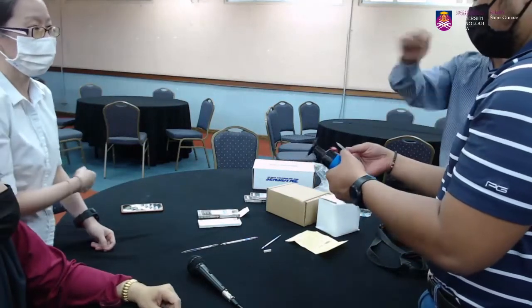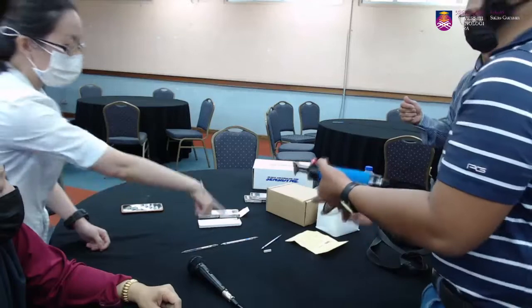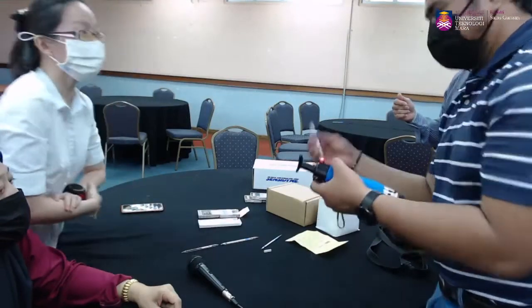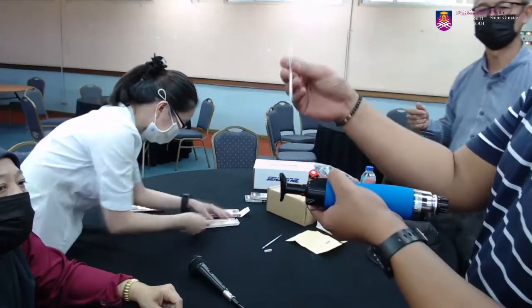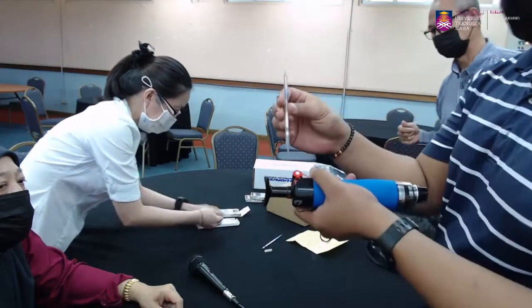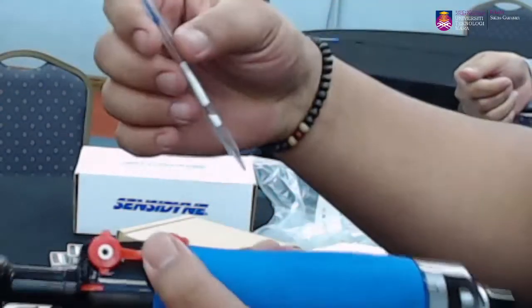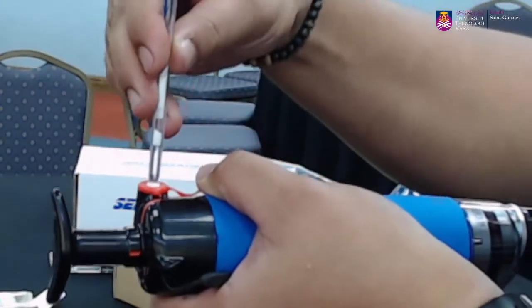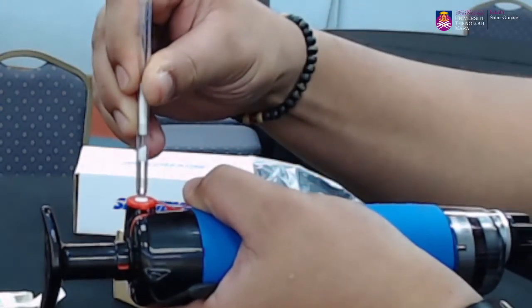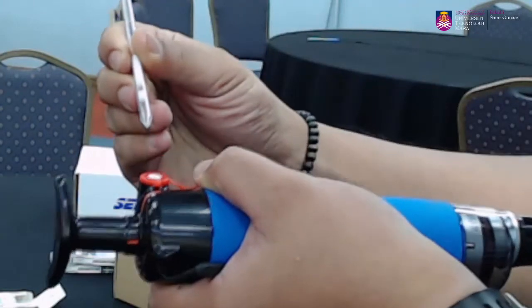Tak apa, patahkan yang ni. Ada empat. Dia memang letak tepi lah. Usually tak kisahlah atas atau bawah dulu, just kita masukkan dia dekat tip cutter ni. Pusing sikit untuk bagi dia celah dan kita breakkan macam tu. Okay, share kita satu dulu.